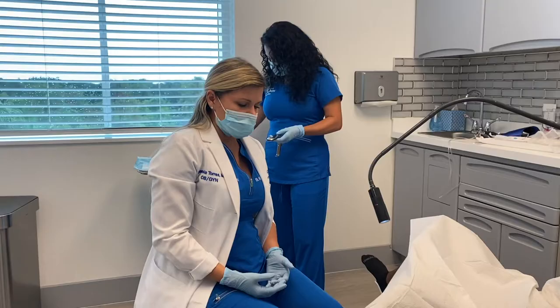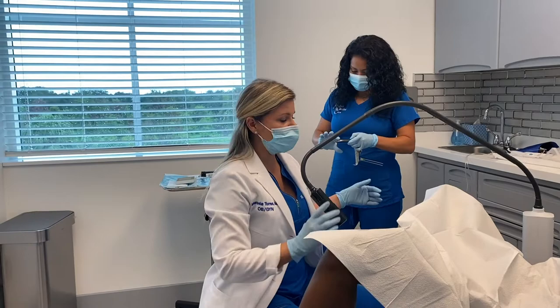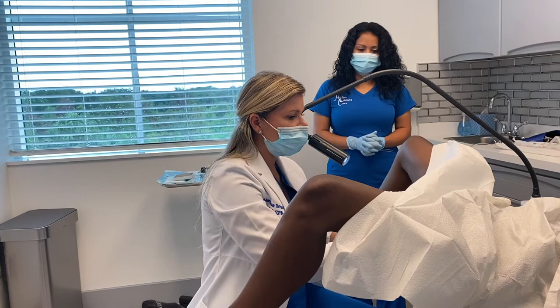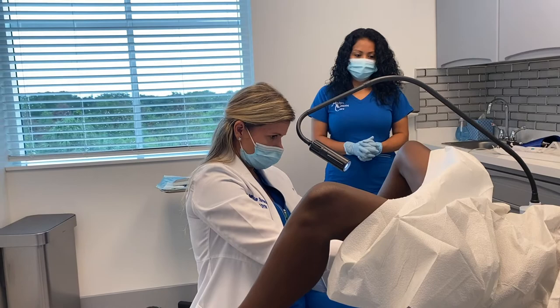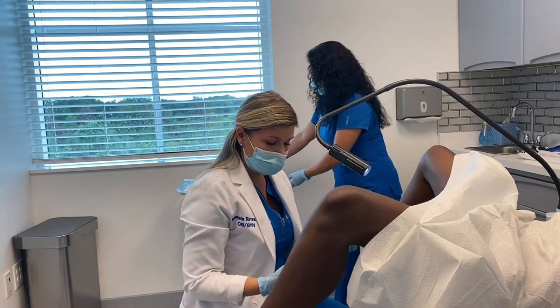So your doctor is gonna ask you to come all the way down and to stay as relaxed as possible for the first part of the procedure. All we need to do is put a speculum just like when they're doing a pap smear. Then the most important is to visualize that cervix, which is where the IUD was placed initially. As I can tell already, there are no strings of the IUD that she got implanted before. And this is the most important reason why we cannot just remove it easily and we have to use the camera.